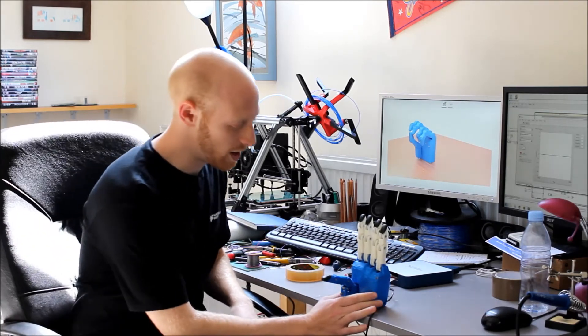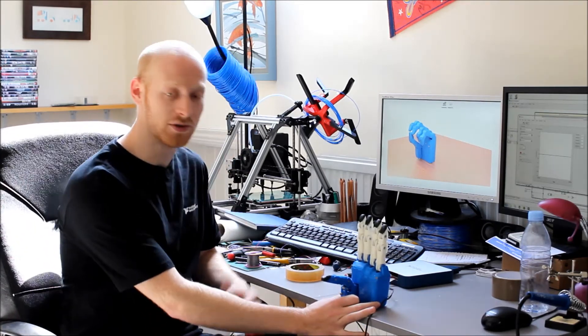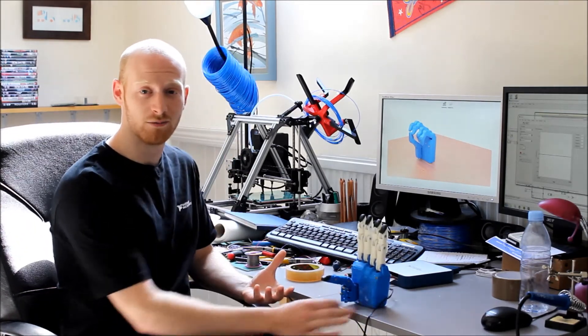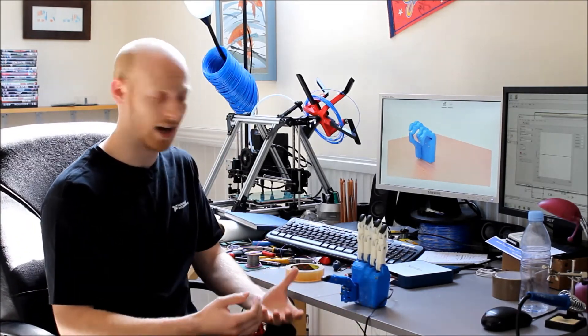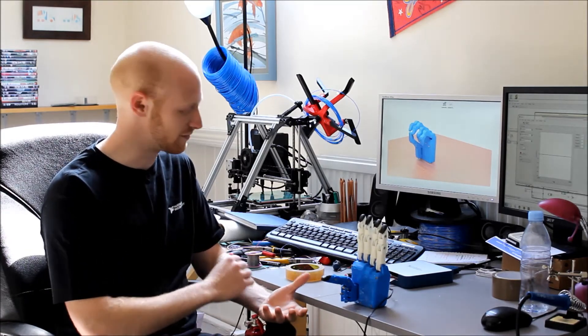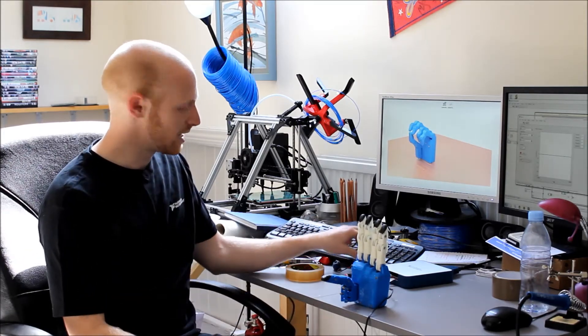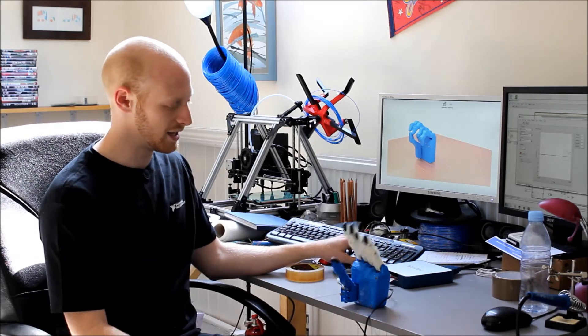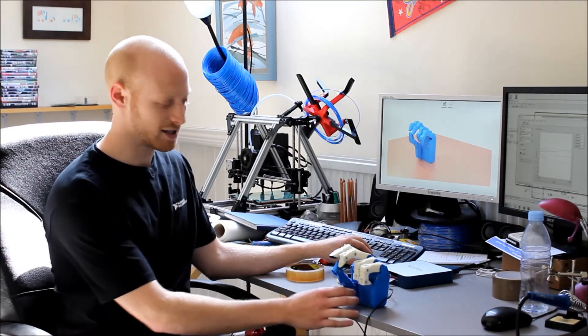So it's wired up to the computer at the moment rather than the EMG signals of my muscles that we saw in the previous video. So I can just press a couple of buttons on the keyboard to make it close and open.